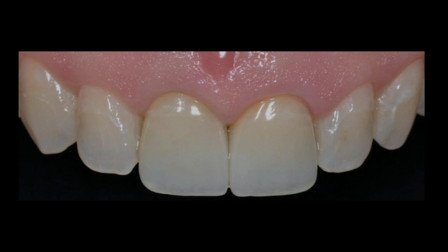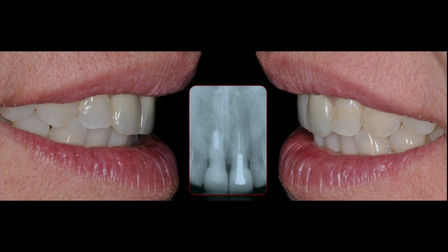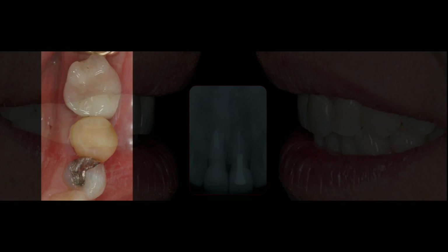So in this case, we take the advantage of both materials, we take the advantage of the design capabilities, and we marry them together to try and provide not only a more durable restoration, but also a more aesthetic one in that anterior segment. So this is how it looks once the patient has been treated and the treatment has been completed.